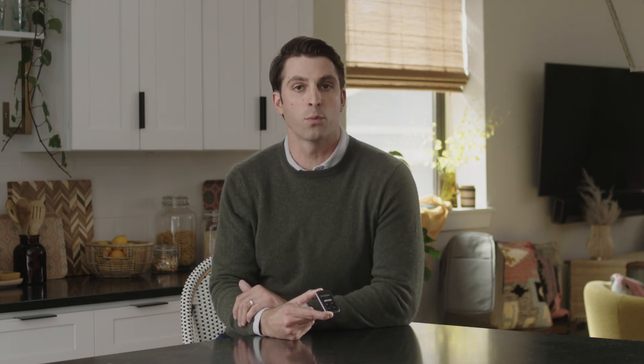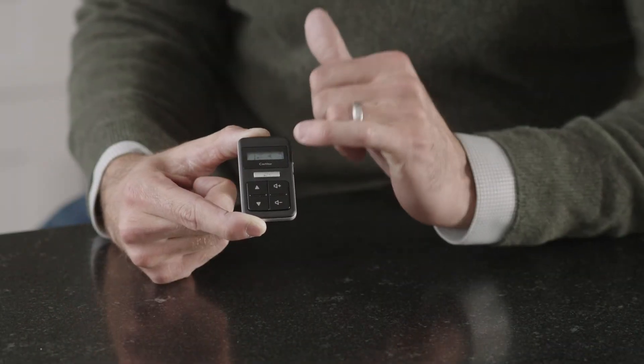If Telecoil is a feature your audiologist has enabled on your sound processor, you can activate it with a short press of the gray button once and the Telecoil icon will appear. To turn it off, quick press again. That's the remote control.